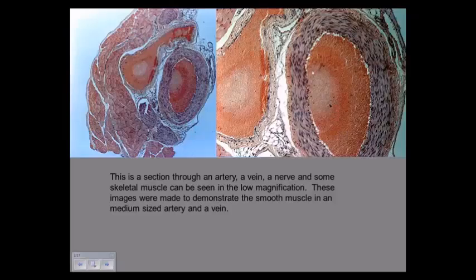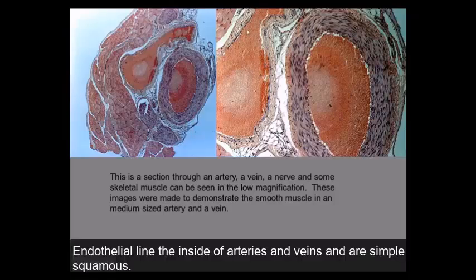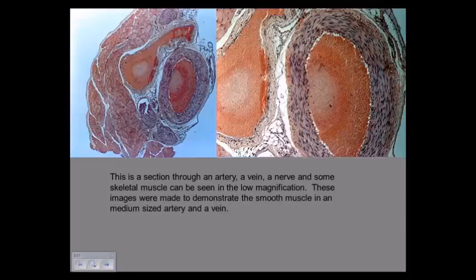Here is a vein in comparison to an artery. Here's a smooth muscle in here. It's really thin in comparison. Okay? And of course you have endothelial cells in there, that you can't see too well, except maybe over here. See this clear stuff, that area that's clear? That's called artifact. Okay, artifact is a result of the tissue separating during the fixative process.